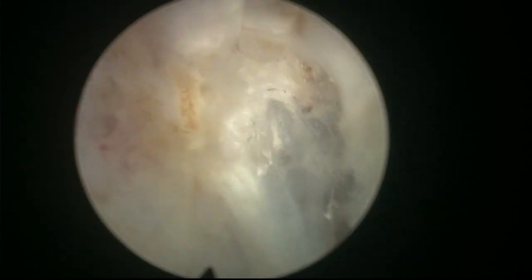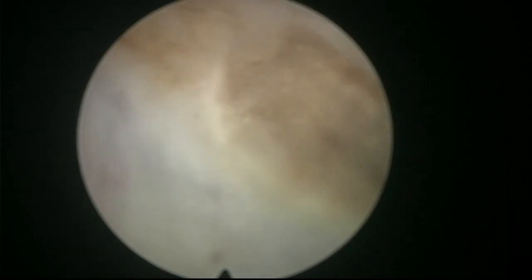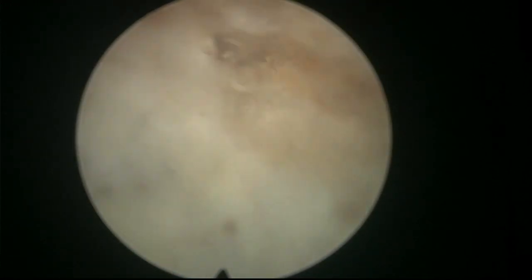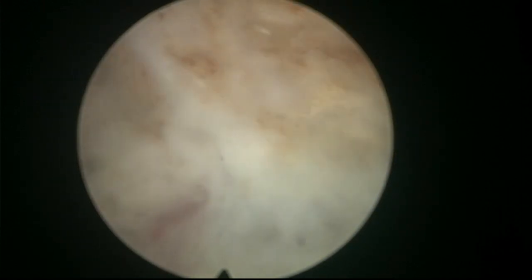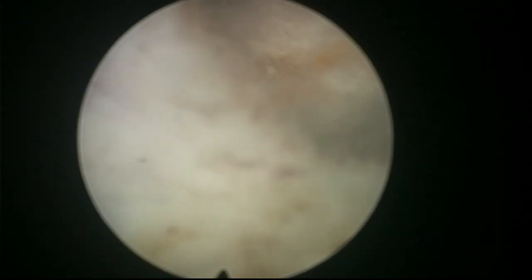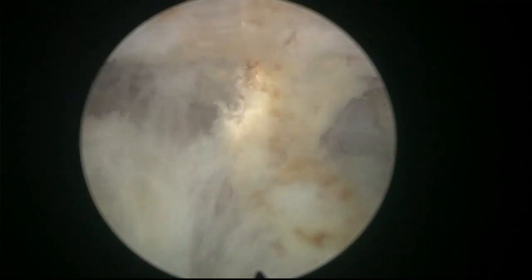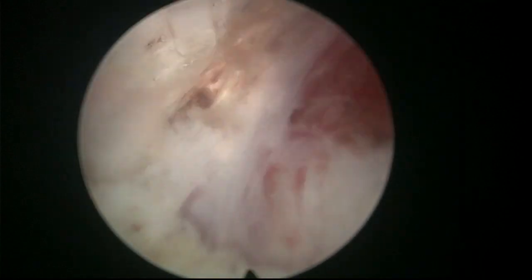Continuing here, of course, I don't want to take the wrong route. So I'm trying to keep my fiber as up as I can to remove the apical tissue. Yeah, so the sphincter is already further back. So we are working in an area that has been released from the sphincter, so I'm not worrying about the sphincter anymore. And here we can cross from side to side. We'll check at the end. Maybe sometimes you could leave a small amount of tissue at the apical level.